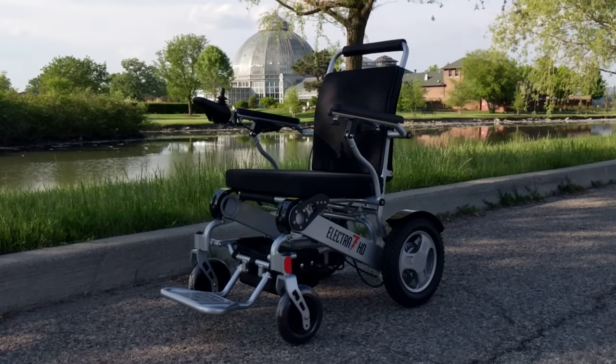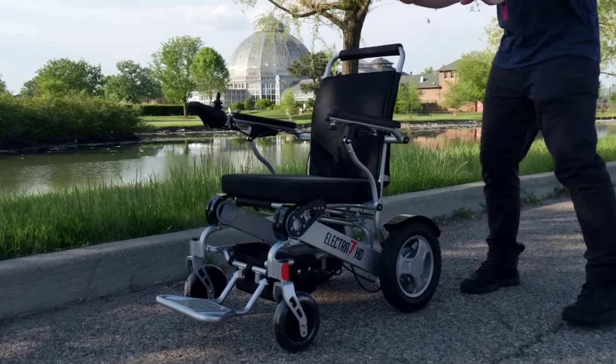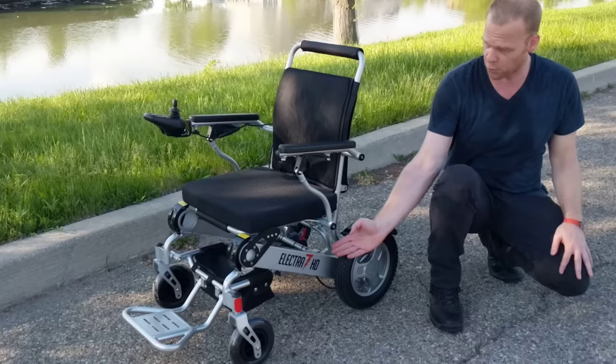Hello, this is Paul from Quicken Mobile and what we're going to be doing today is giving you an overview of our Electra 7 Power Folding Wheelchair.